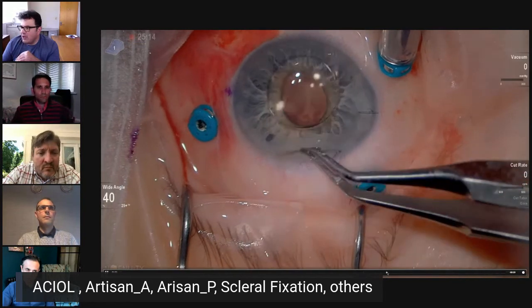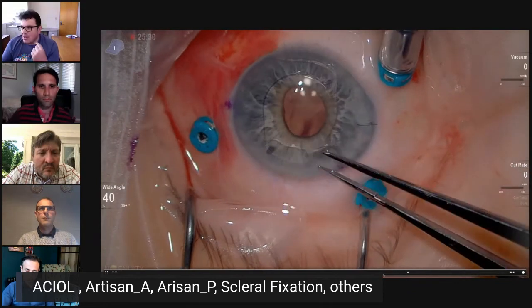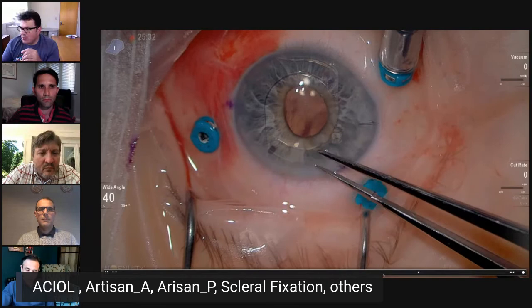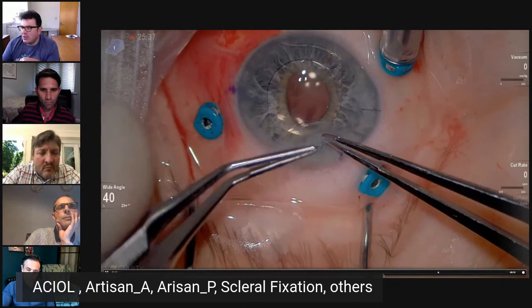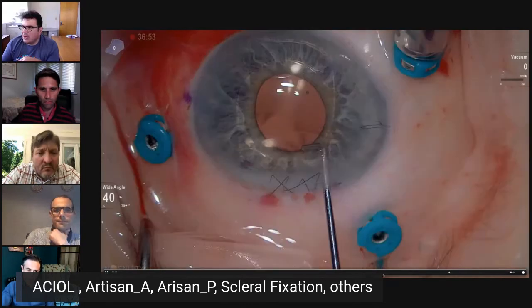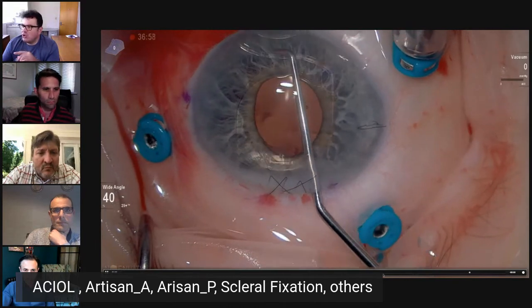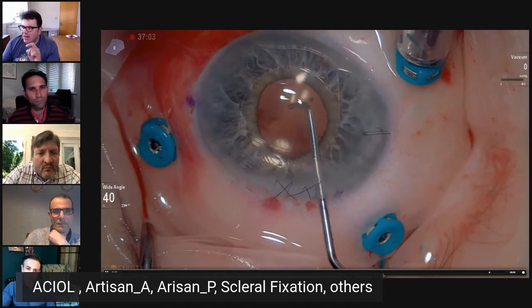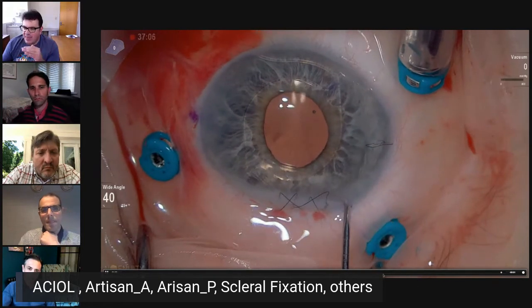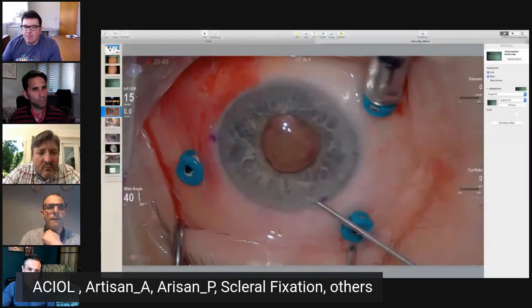And now the trick here is you don't want only to push it inside, but you want to push inside and under the wound. At the beginning, especially for new surgeons, lift and make sure that your haptic is not in the wound. And then if you have any distortion of the pupil, best to sort that after you suture. All you need to do is lift up the lens centrally and up towards the cornea, and then let go. That will clear any iris attached to the lens, and will clear any peaking.